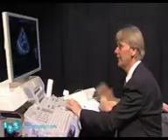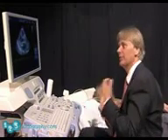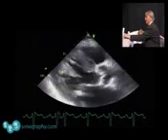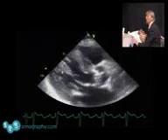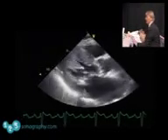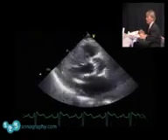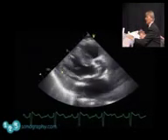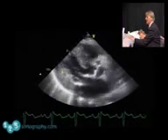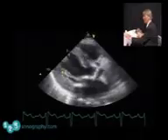What is important in this patient is to look at the anterior leaflet and ask yourself the question if there's a doming. So I'll try to optimize the image here. So you can see there is no doming, but there is some degree of reduced opening of the mitral valve. What is apparent just by looking at the parasternal long axis view is that there's a lot of calcium, that there's a calcified annulus here, but it's also nice to see that the posterior leaflet and the anterior leaflet, even though they're thickened, are still mobile and that they open.